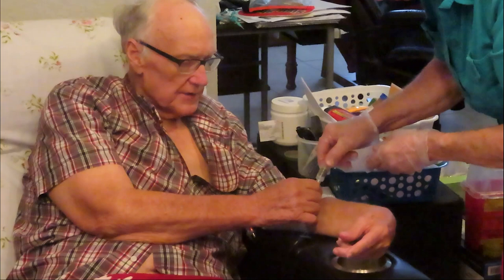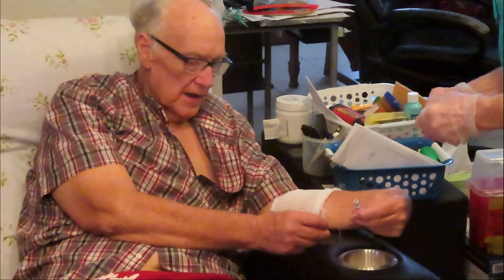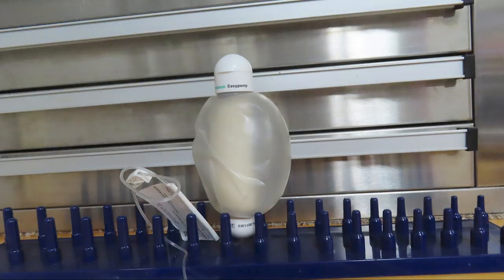So this one's clean now. These fittings here don't require lids where the other fittings do. So these don't have any green lids on it. This is like a check valve in there. All done with my PICC line.